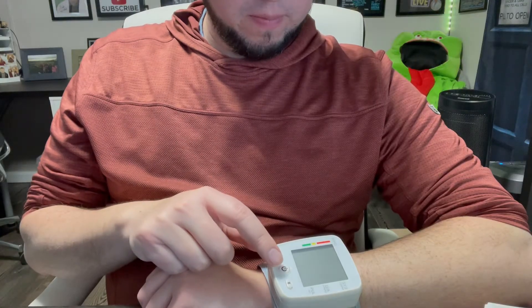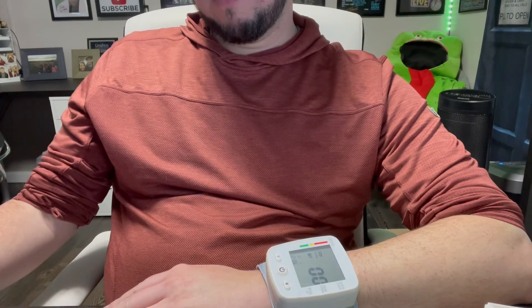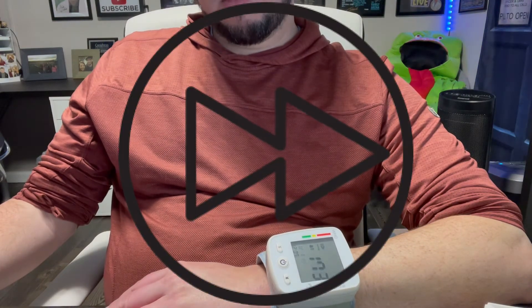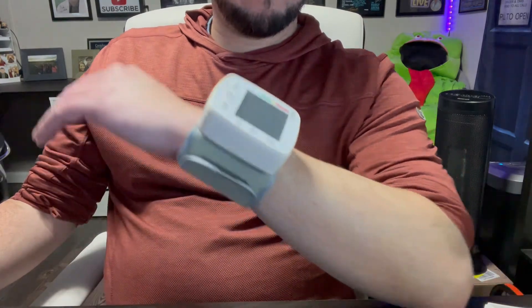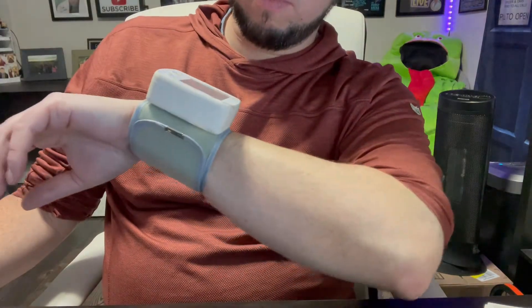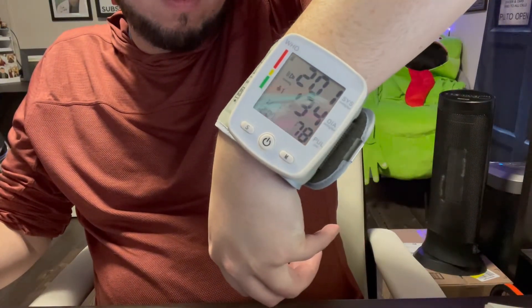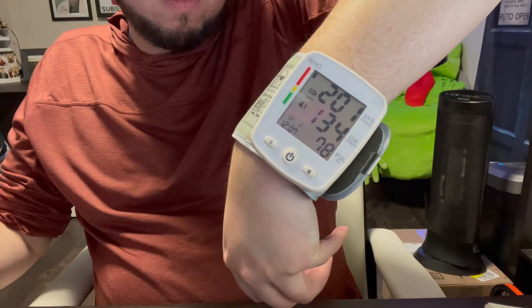Okay, let me try this on the other wrist — without holding the camera this time. I'm just going to relax. The device says: 'Please remain seated and refrain from talking during measurement, and keep cuff at heart level.' Your blood pressure is: systolic 201 millimeters of mercury, diastolic 134 millimeters of mercury. Your pulse was 78. Your blood pressure is abnormal.